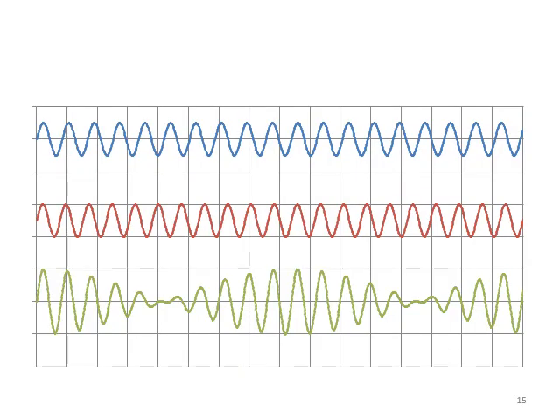So as you can see in this slide, one channel is shown in the blue color and another in the red color. When the currents are given through both the channels, the currents interfere with each other's frequency. In the initial phase, as you can see, the peaks of blue and red are having an additive effect, and somewhere in the middle they are having the cancellation effect.